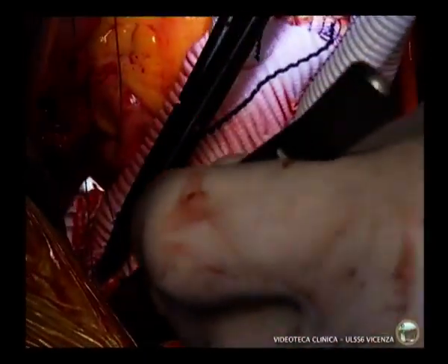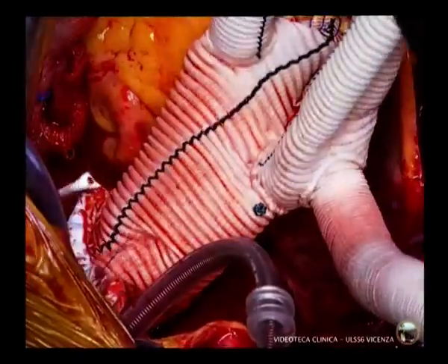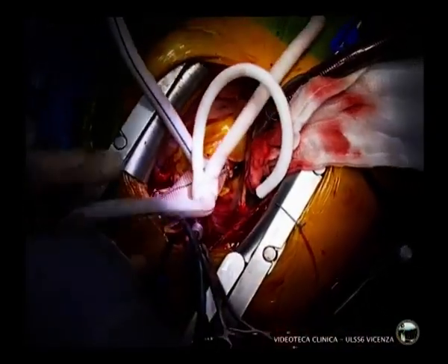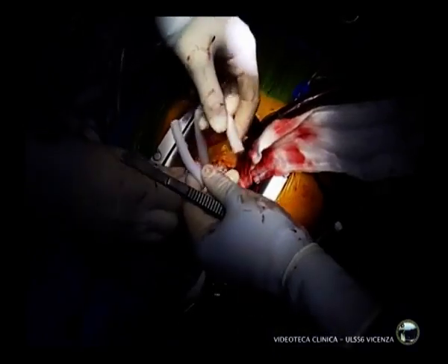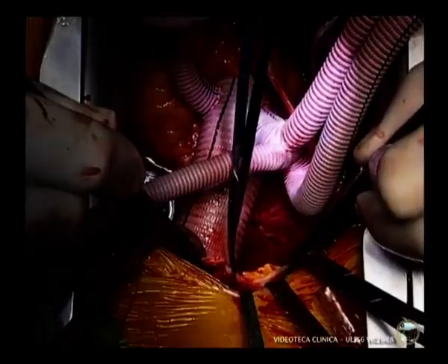A distal anastomosis between the vascular graft and the aorta is performed with a 3-0 polypropylene suture interposing a Teflon strip. The anastomosis is completed by de-airing the chambers of the heart. Then the systemic perfusion is restored, and the aorta is subsequently declamped. The antegrade cerebral perfusion is still running.